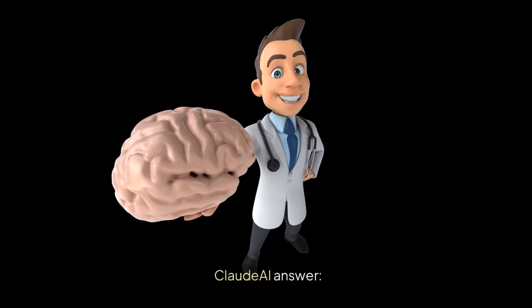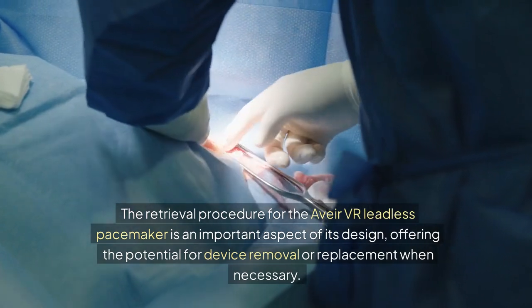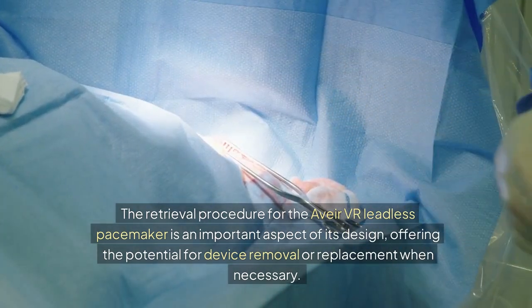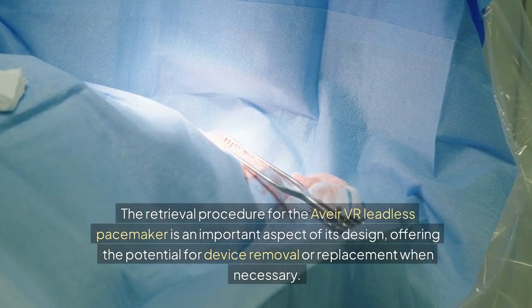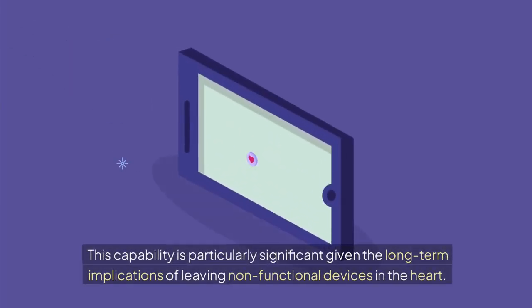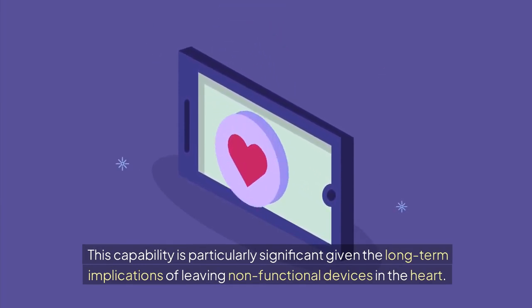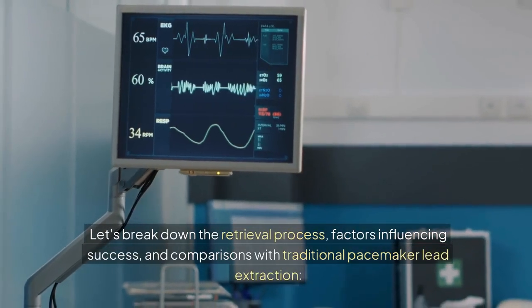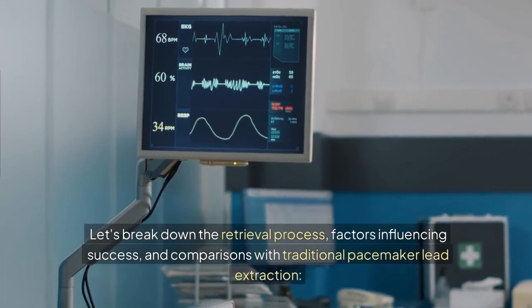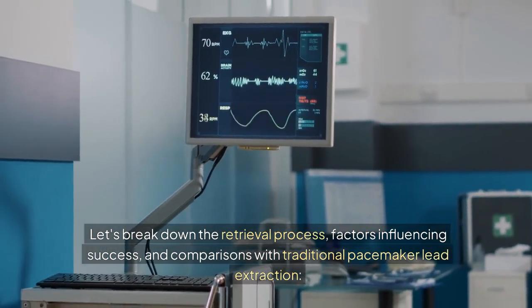Claude AI answer. The retrieval procedure for the Aveir VR leadless pacemaker is an important aspect of its design, offering the potential for device removal or replacement when necessary. This capability is particularly significant given the long-term implications of leaving non-functional devices in the heart. Let's break down the retrieval process, factors influencing success, and comparisons with traditional pacemaker lead extraction.